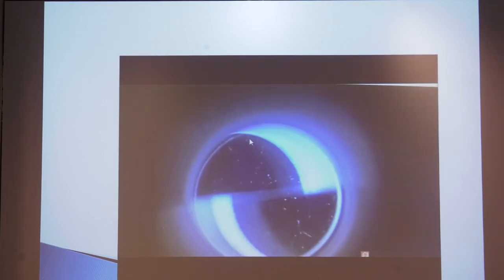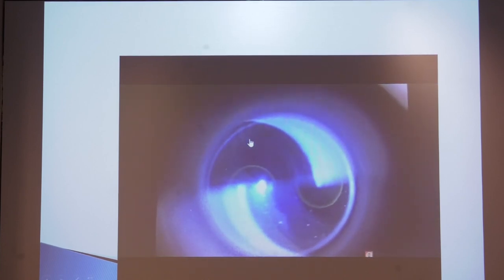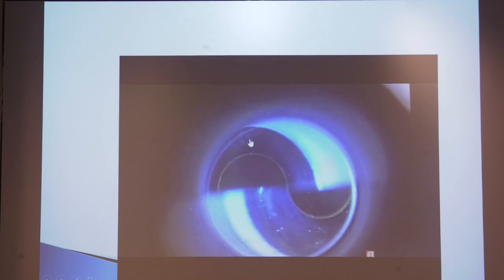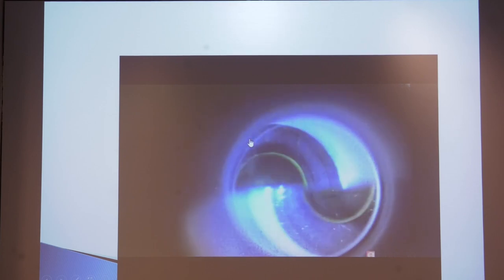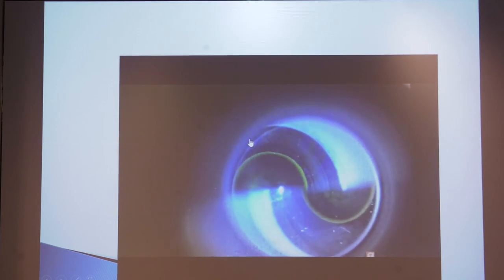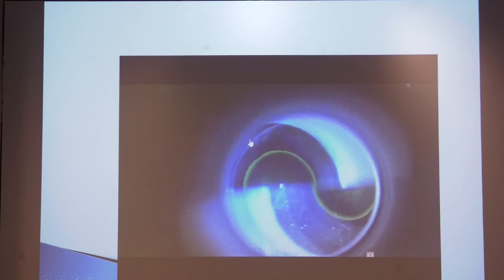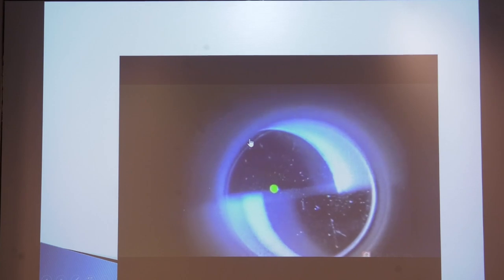Now another video — how we see the meniscus, or mires. This is a thin mire. Tell the patient to blink once or twice so that the fluorescein spreads nicely. We will get the typical ideal mires. This is the endpoint where you get the cardiac cycle. At the inner point, the inner semicircle has joined the inner part — this is the ideal mires.